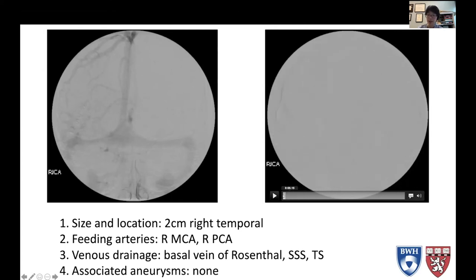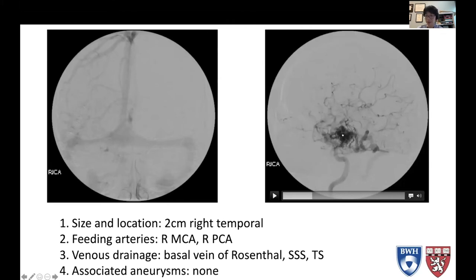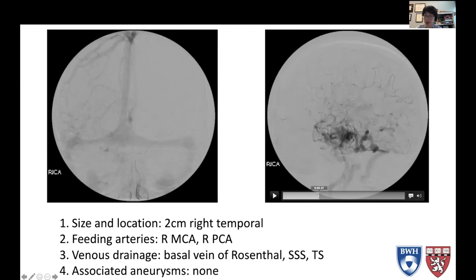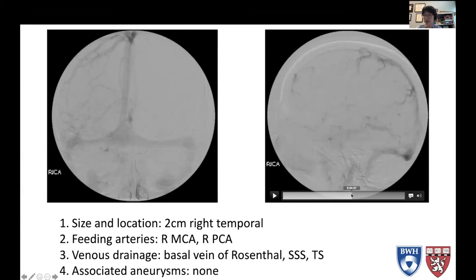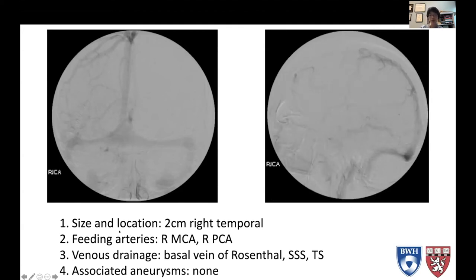This is the lateral view. Here again, this is the internal carotid artery going into the middle cerebral artery. You can see the AVM and the draining veins from the AVM — some of the basal vein of Rosenthal — and drainage into the vein of Labbé and into the transverse sigmoid sinus. Again, this is still in the arterial phase, and you're seeing all these veins. The actual capillary phase doesn't happen until right about there.